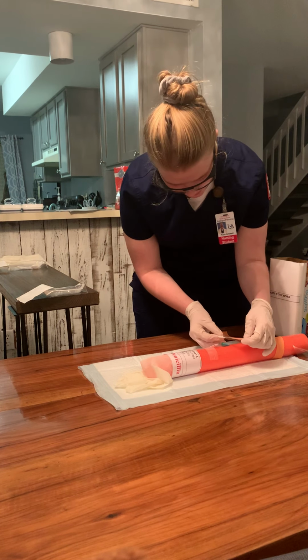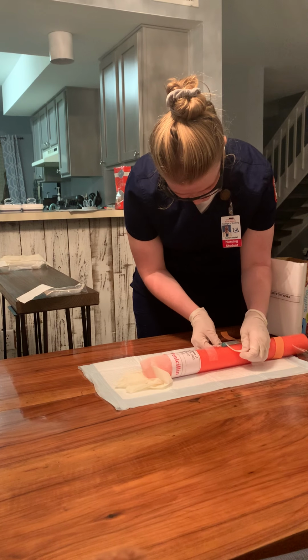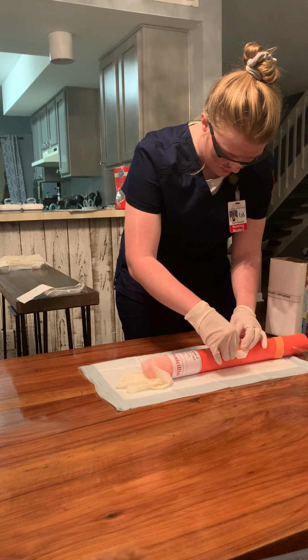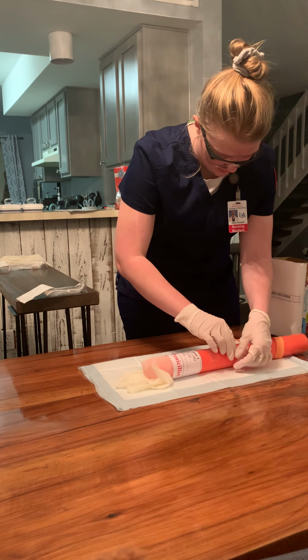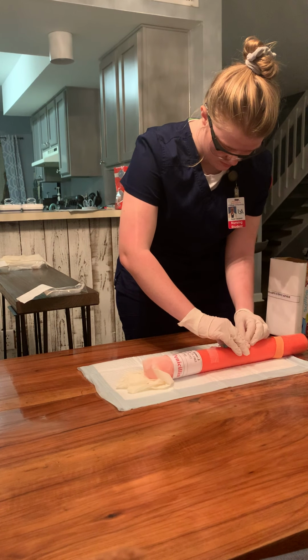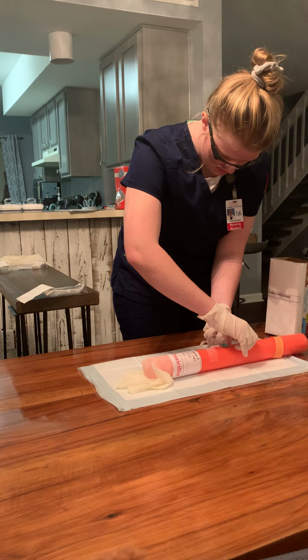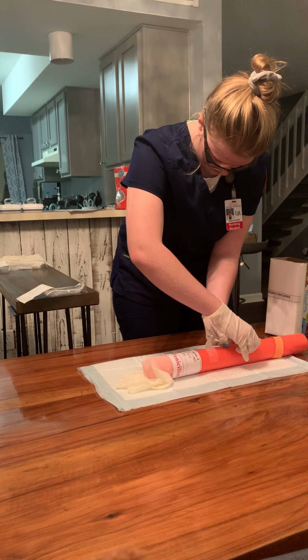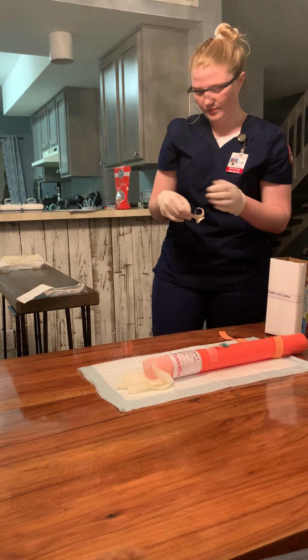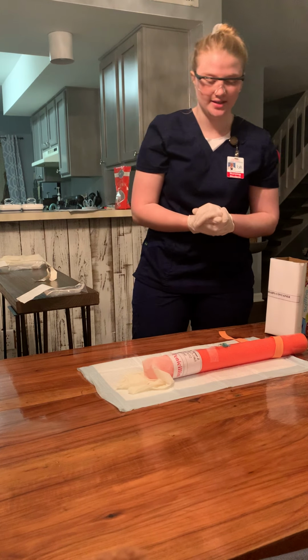making sure to not go all the way over the hub, but to get it on there. And so now I'm just going to remove the outer wrapping, make sure and press down the edges well. And I'm going to set this aside and save the label sticker.